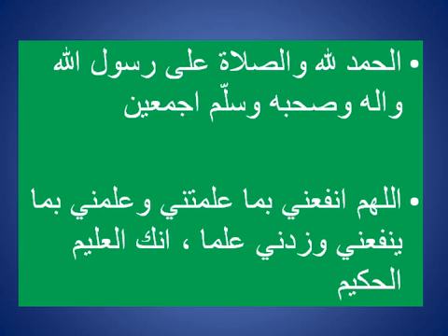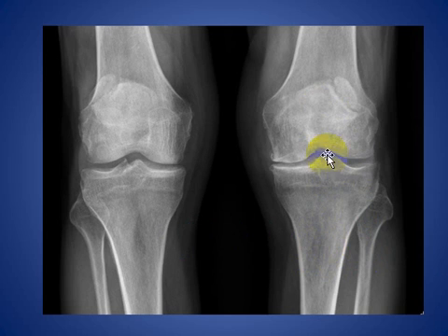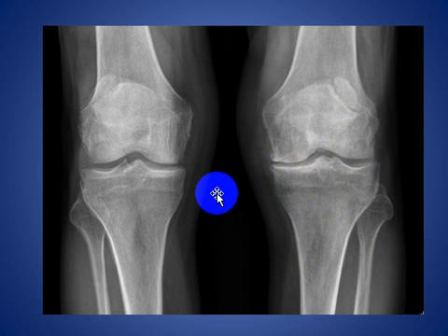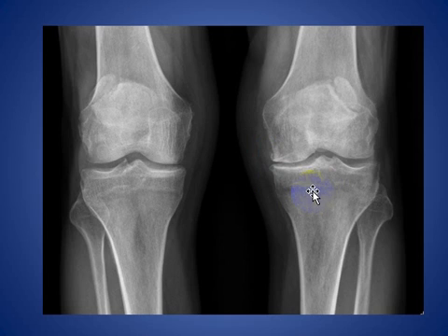I will represent a musculoskeletal case. As you see here, this is an X-ray of both knees in the AP position. We can see degenerative joint disease involving both knees, more on the left side, with some osteophytosis. There is no definite malalignment noted.